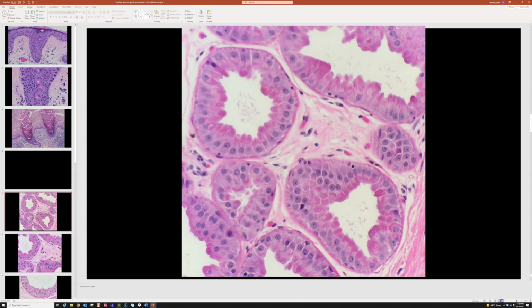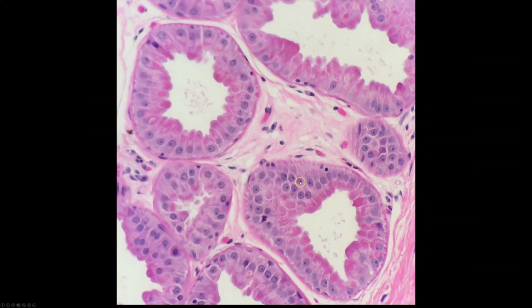All right, so to reiterate, this is a good example of how big and round the nuclei are and how prominent those central nucleoli are. And look at the really bright pink granules. These seem to always be present in apocrine secretory cells to me, but every once in a while they stand out much more vividly, and I think it depends partially on the quality of the hematoxylin and eosin stain from case to case, or maybe the fixation or something else. So this was a particularly beautiful example I saw.